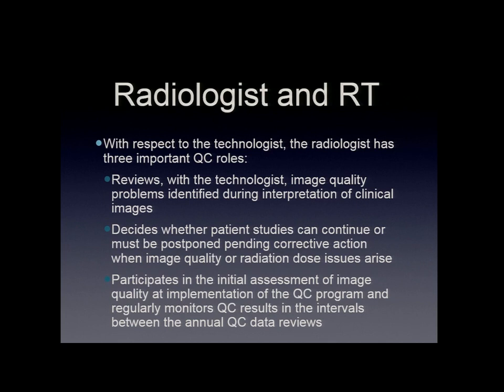Now, the radiologists and the technologists have a really vital role. They need to review day to day any image quality problems that they see. The radiologist should say, I see some rings in my clinical images, or I see this artifact. They need to relay that to the technologist and let them know so they can look at their QC and follow up on that.